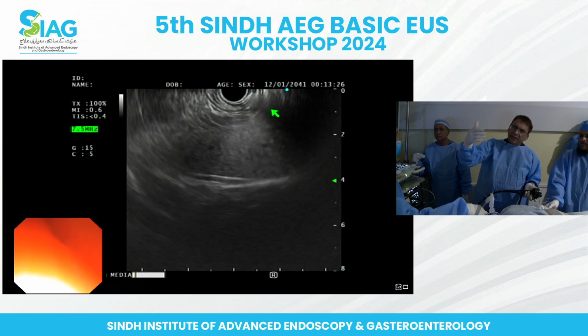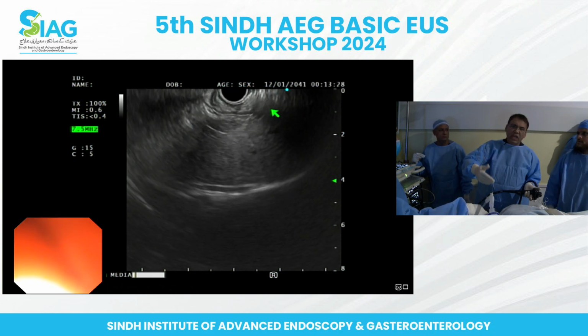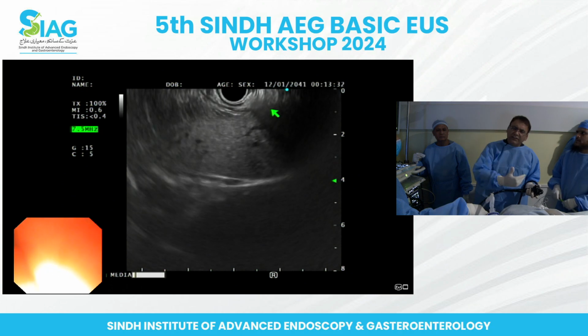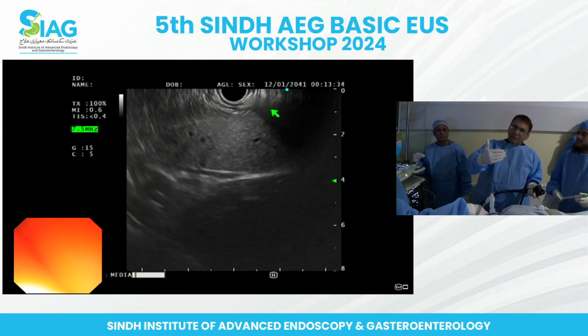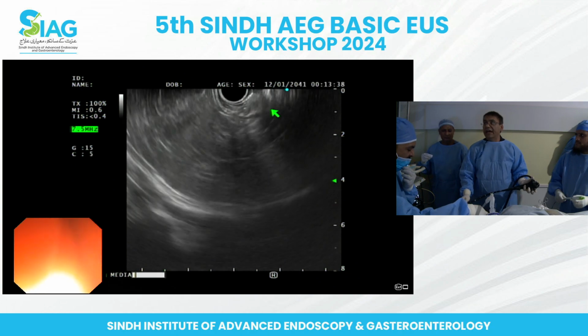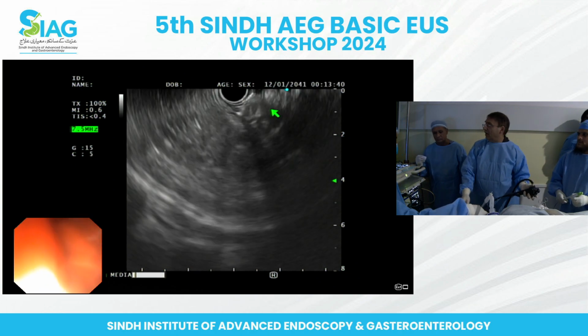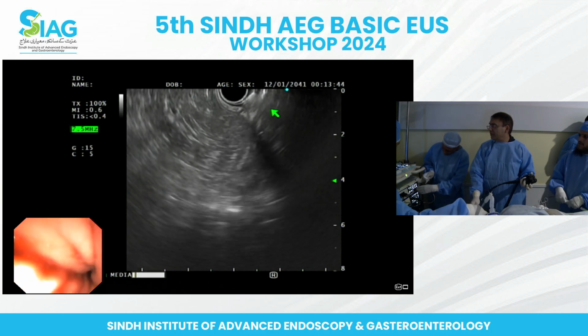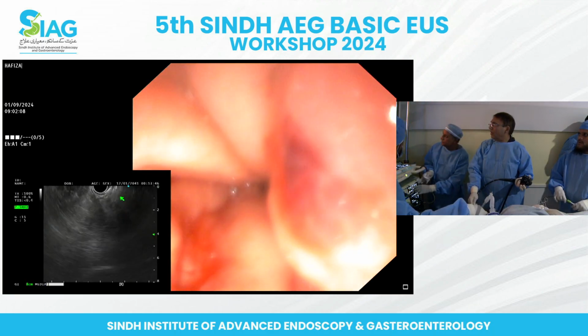You can see the whole segment 2, the whole segment 3, the whole segment 4, to some extent pretty much all of segment 8 as well, and segments 5, 6. The majority of the liver you should be able to see. So here the way we'll start with the — एक मिनट, मुझे वो दिखा देना endoscopic view, ठीक है? तो ये ठीक.